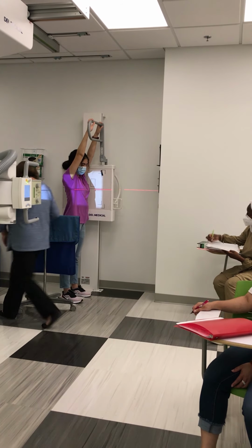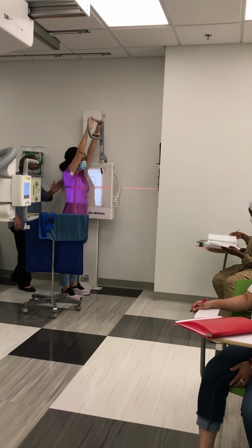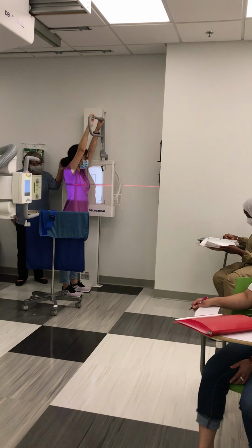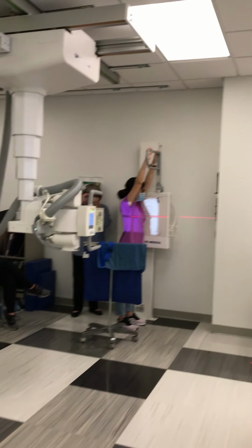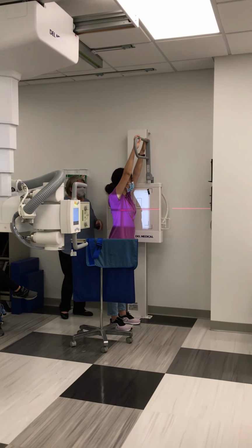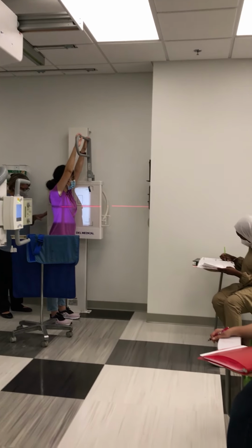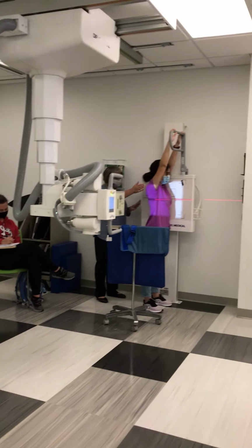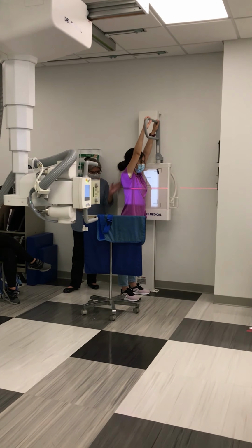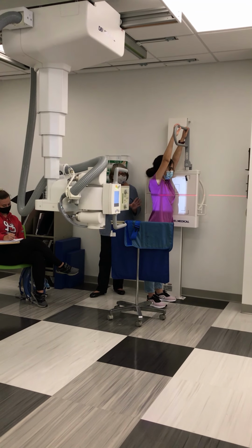Now then, I'm going to position my patient. And you can see, Alex, there's quite a gap between my patient's left side and the wall bucky. I'm going to tell my patient, step to your left against that board. Okay. Now, her whole side is against the board, from shoulder to hips. That's good, that's what you want.